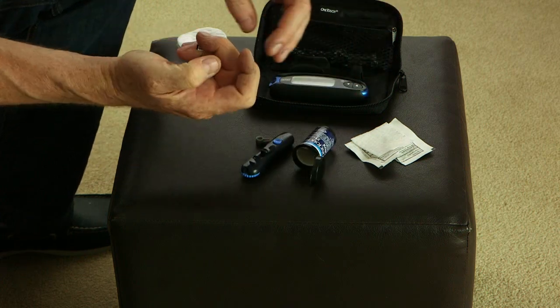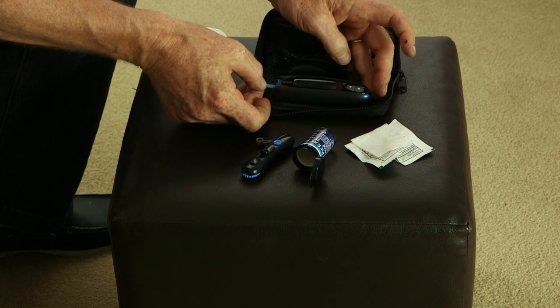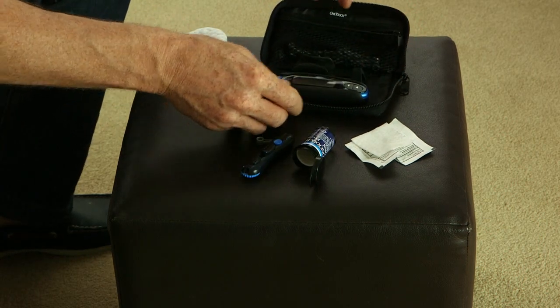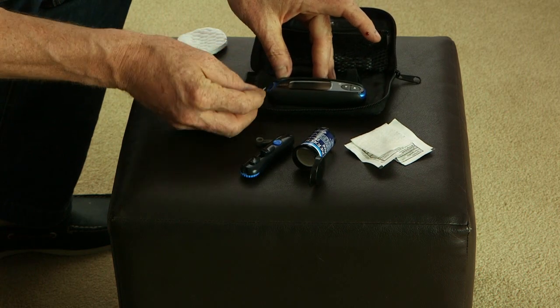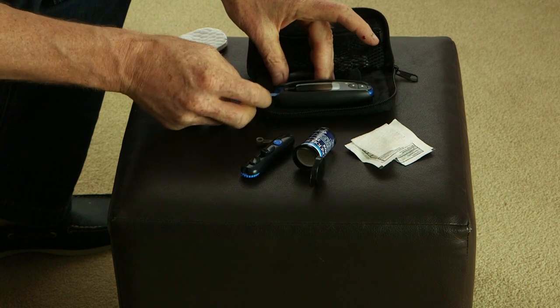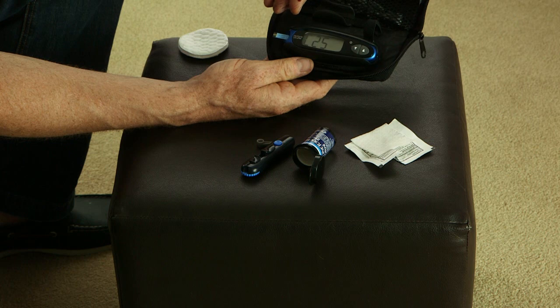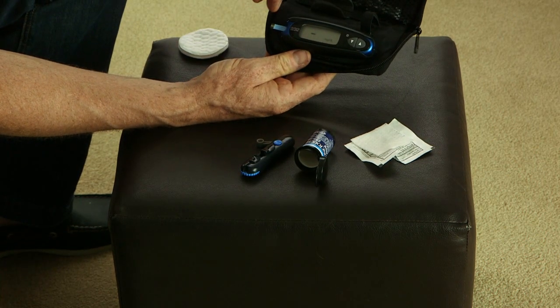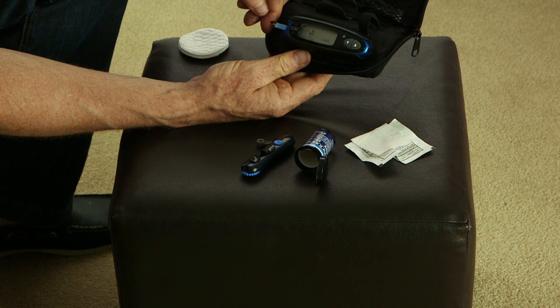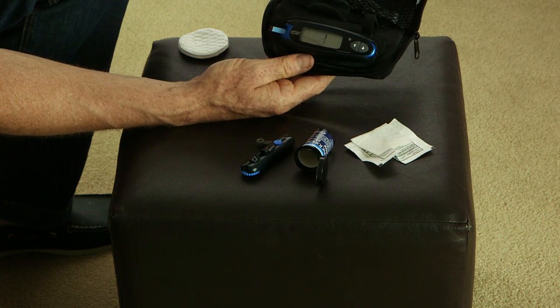So you'll then take the slide, ideally without handling too much of it, and just put it in. That turns the machine on. If you get it in the right way, there we go. That turns the machine on, so it confirms that it's the C25 slide, that's C25, and it's all ready to go. It's showing this blinking dot, a drop of blood. We get a countdown, and you've got your reading.